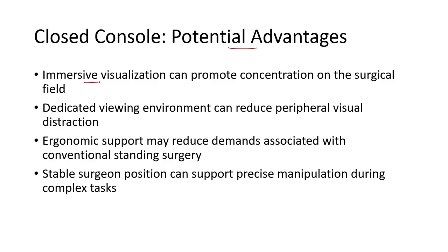So what is the potential advantage of closed console? It gives the surgeon immersive visualization and can promote concentration on the surgical field. The surgeon puts their head into the headrest and can see with the optical 3D viewer. So he is completely concentrated on the surgery only. That dedicated viewing environment can reduce peripheral distraction. Just because he is doing everything with the dedicated eye viewer, he is completely in the surgeon console. He is inside the OT, but he is isolated because of the dedicated viewing environment.